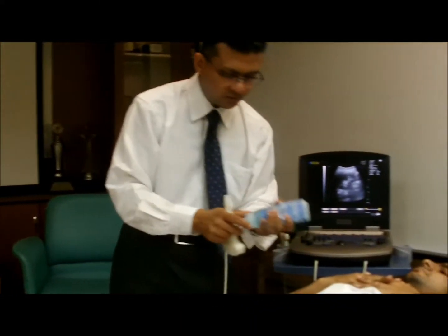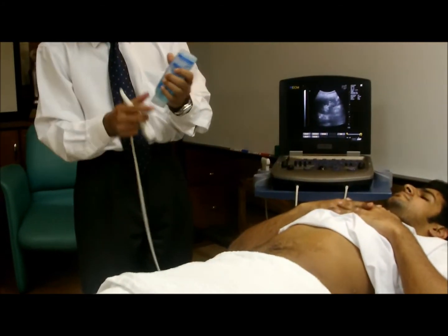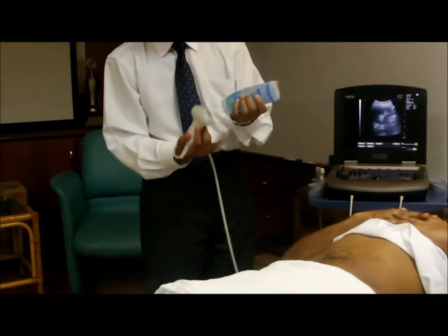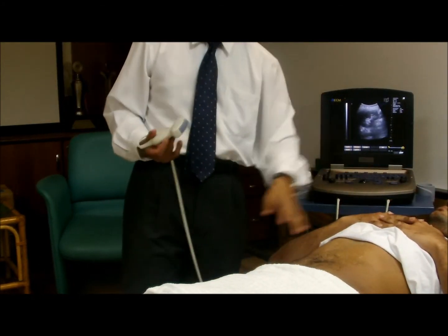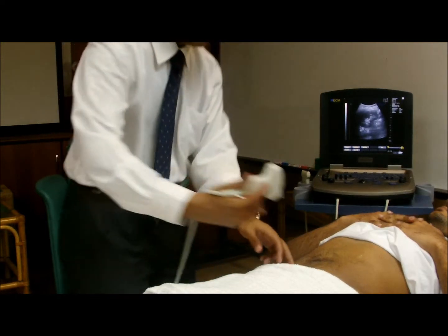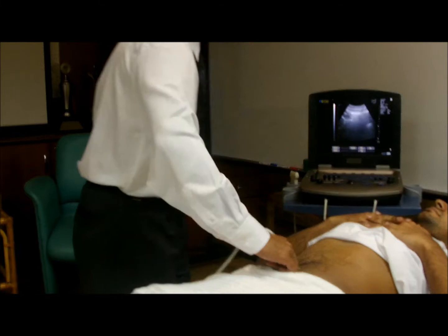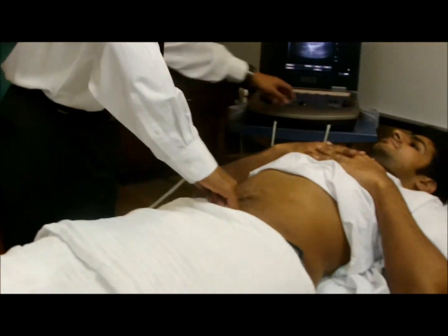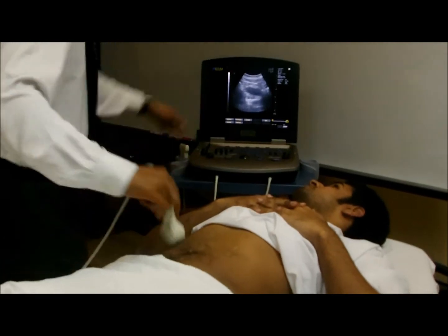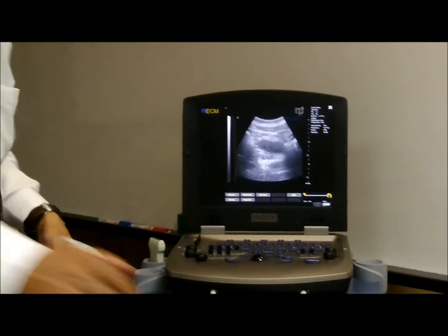and you can see whether there's any hydronephrosis. And you could move on to just take a quick look at the bladder, because sometimes, especially if you see hydronephrosis on both sides of the kidney, there may be a common obstruction over the bladder, and you might be able to see some urethral stone along the way. If you see here, this is actually your bladder, and underneath it is your prostate.